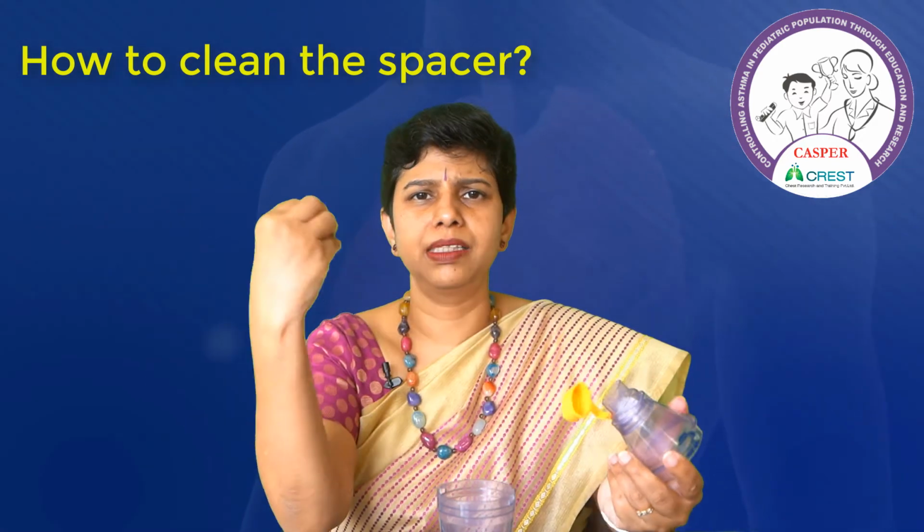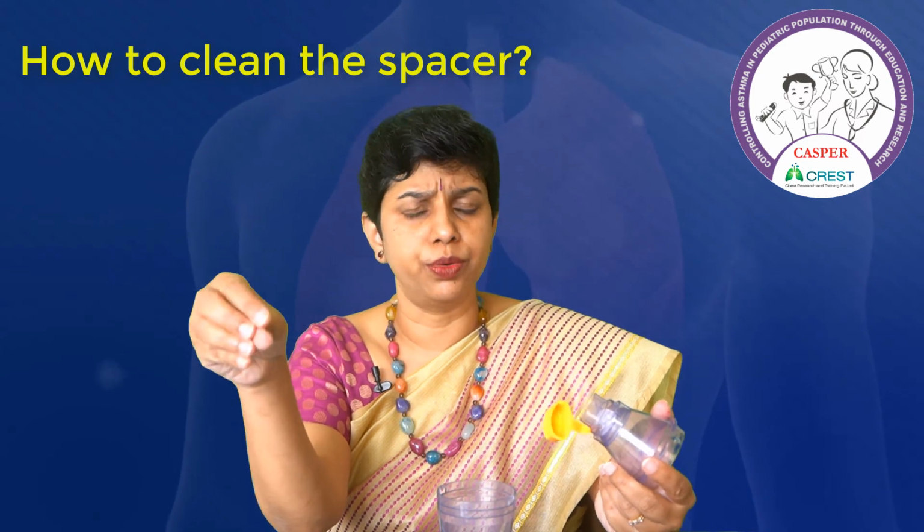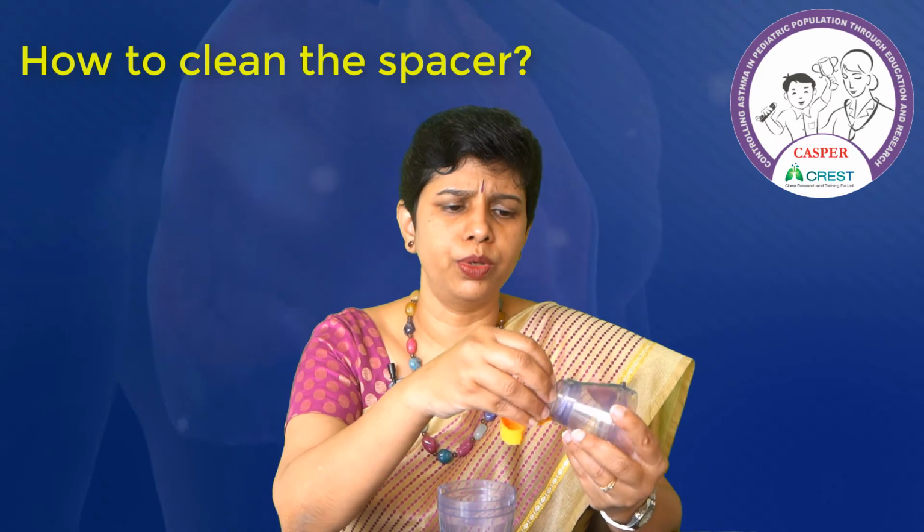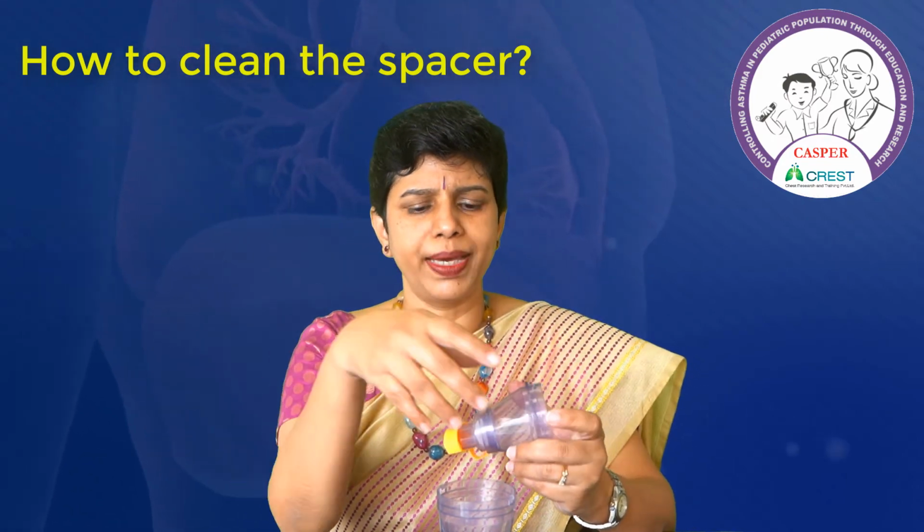What I advise patients is, every time the child has taken the inhaler, just wipe it off with a toilet tissue roll. They can keep a toilet tissue roll handy. Wipe it and just throw away that piece of tissue. If they use a cloth, they'll be using the same cloth again and again. So better to advise to keep a toilet tissue roll. Just wipe it and throw it away.